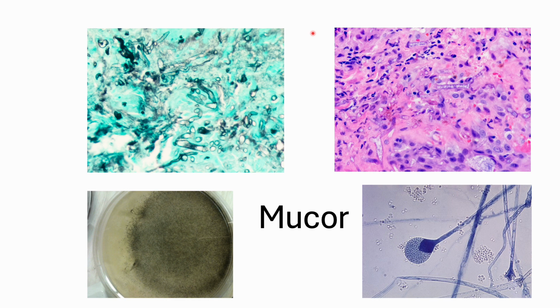However, I would like to point out the 90-degree angle should only be evaluated on the cultured tissue. In human tissue, the morphology can be altered because of the patient's immune system, or the patient using any anti-fungal therapy that can alter the morphology of the fungus.